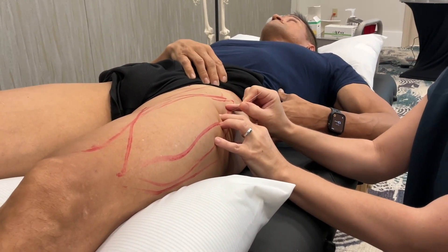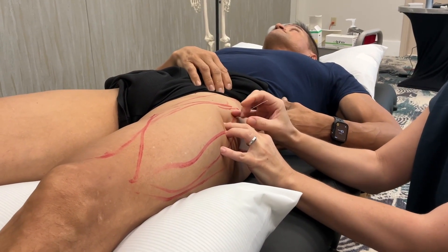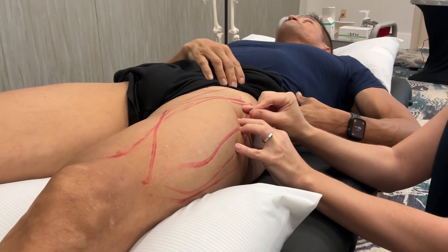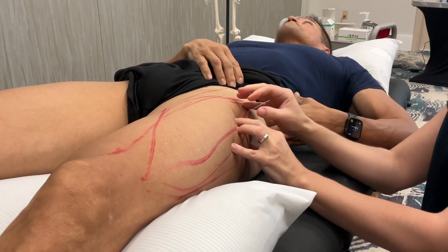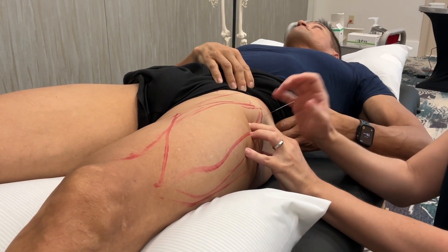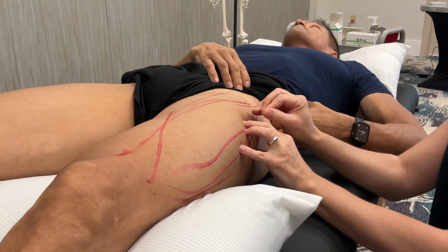Nice and smooth. That was a very nice jump. Another nice jump. How you doing, Moses? So now I'm in his bone. Got another jump with withdrawal there. Got another one. Got another one.